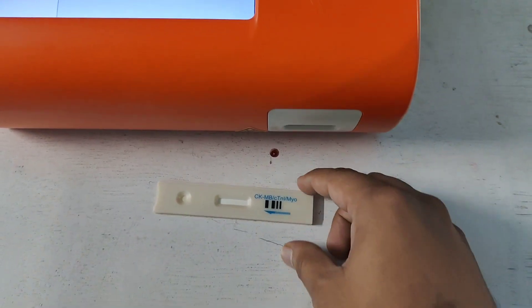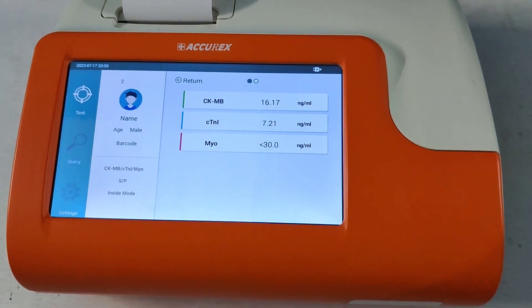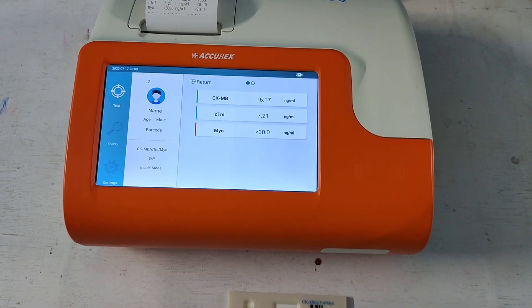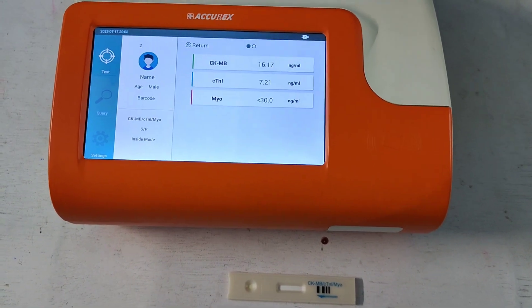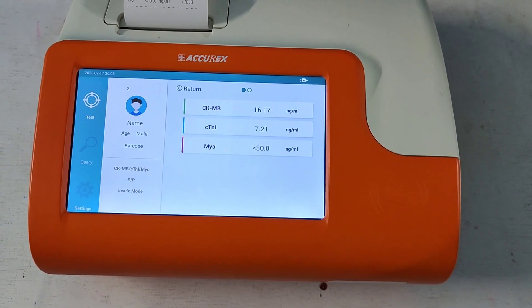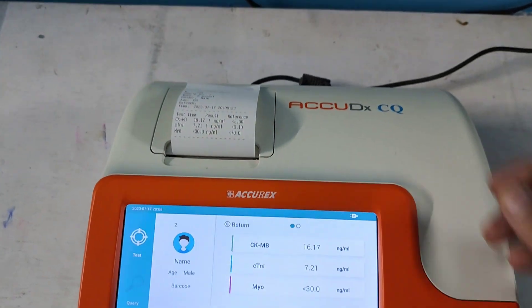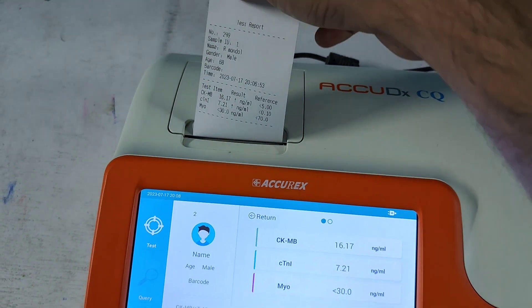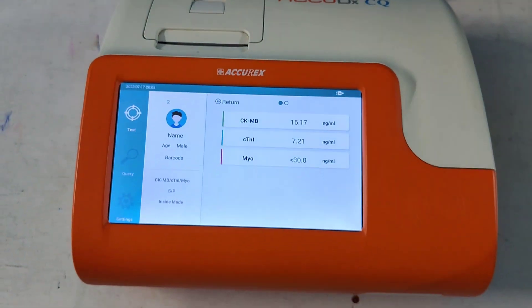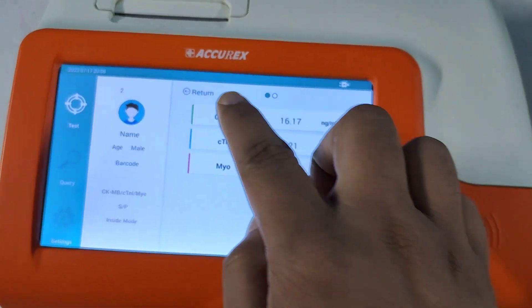The kit is automatically ejecting. Within 10 minutes I can get the result of 3 cardiac markers at a time — CKMB, cardiac troponin I, and myoglobin. Here is the printed result — I am going to detach it. After performing the test, you have to press the return button.